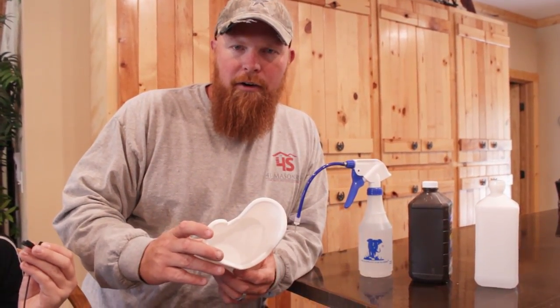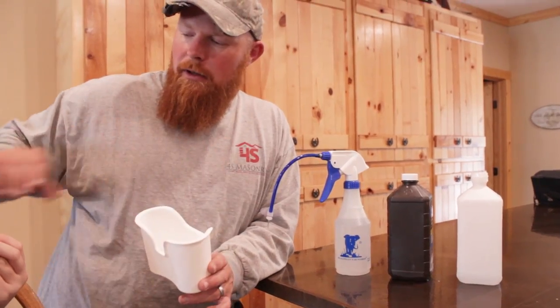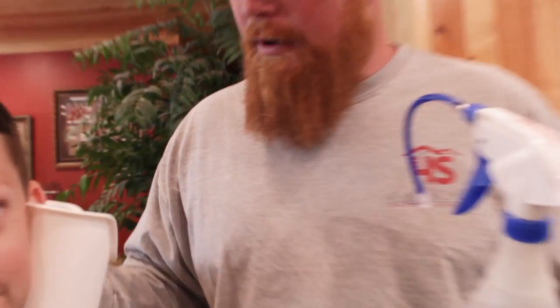This little ear basin catches the fluid that comes out of the ear and catches the fluid that you're spraying at the same time. I've got my son here and we're going to demonstrate how it works. You could probably buy the Elephant Ear Wash by itself, but I would get this little container as well because it fits neatly under his ear.